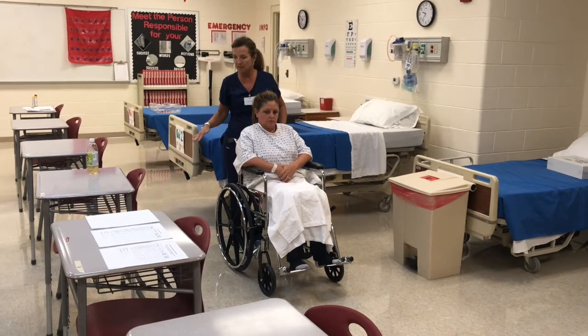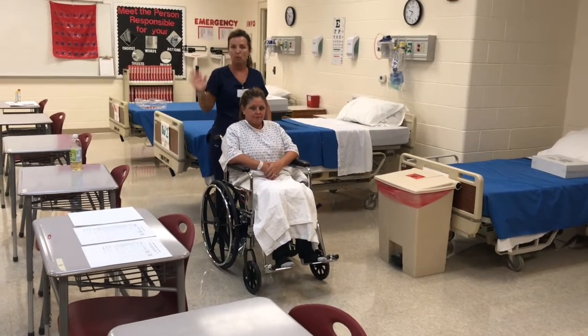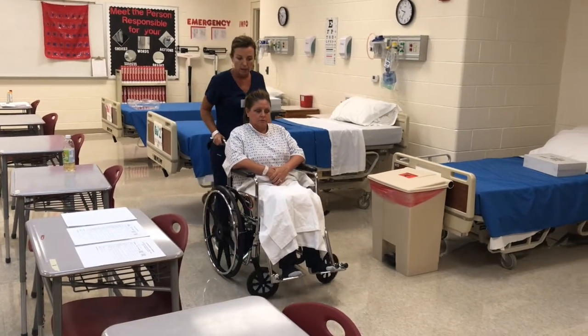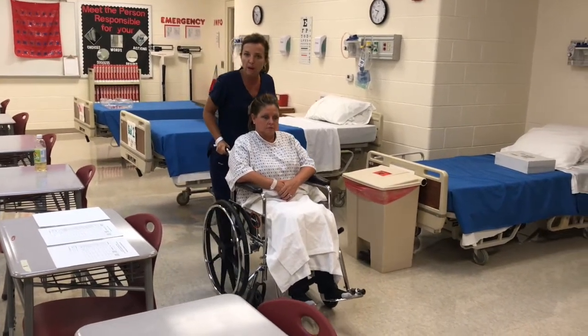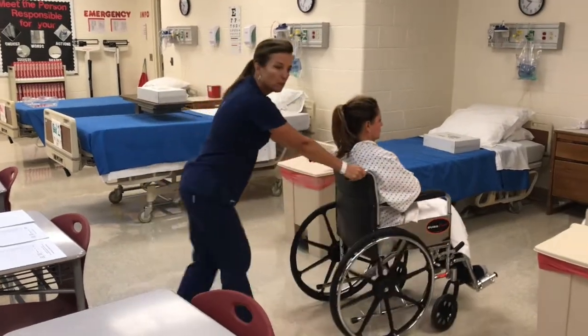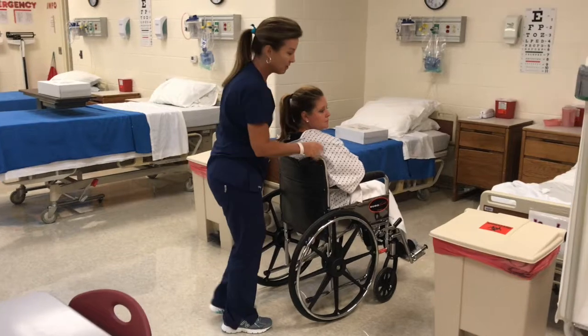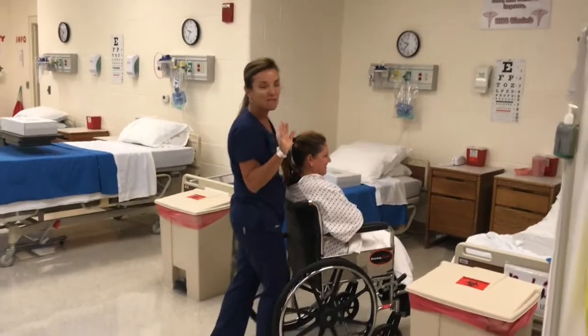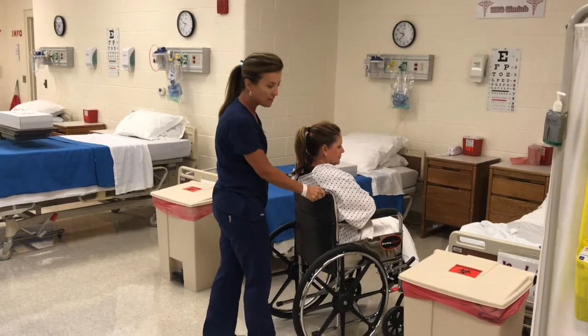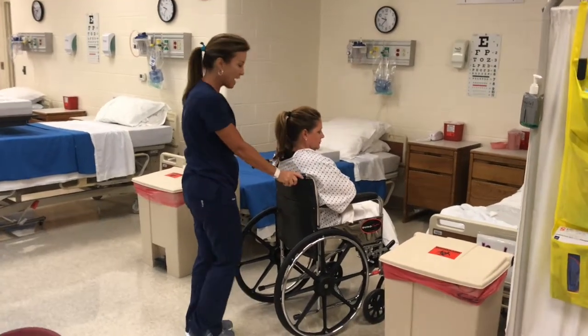So we've gone downstairs, gotten our x-ray, we're finished, we're back in the elevator coming back up, doors open, and here we go. Again, you're going to use your body weight as a counterweight to get it pushed and started. You're going to go back into the room and stop your wheelchair towards the end of the bed so the patient has room to get out.